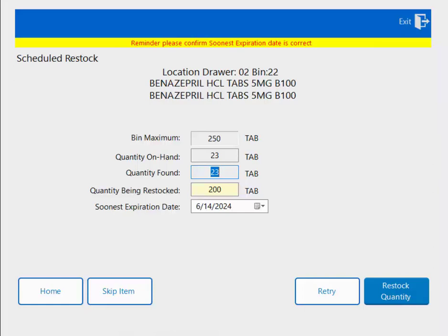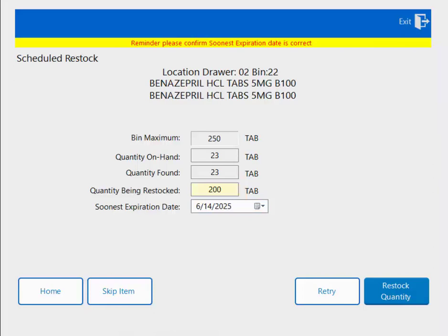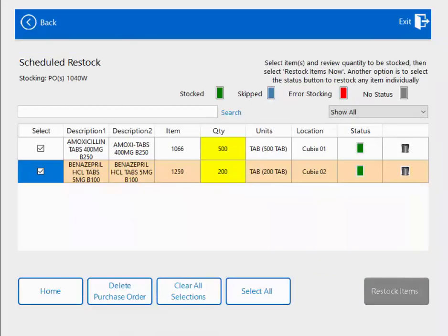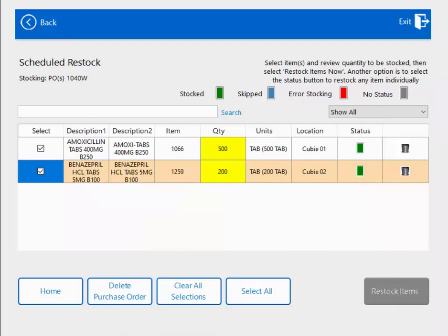Again, I have the quantity on hand. I can do a cycle count and change it if I need to. I'm restocking 200 tablets, or two bottles, and I'm going to update the expiration date. Once I've done all of that, I'm going to close my Qubex lid, close my drawer, and hit restock quantity. Now I'm taken back to the purchase order screen to confirm under the status column that I did in fact restock both of these items.